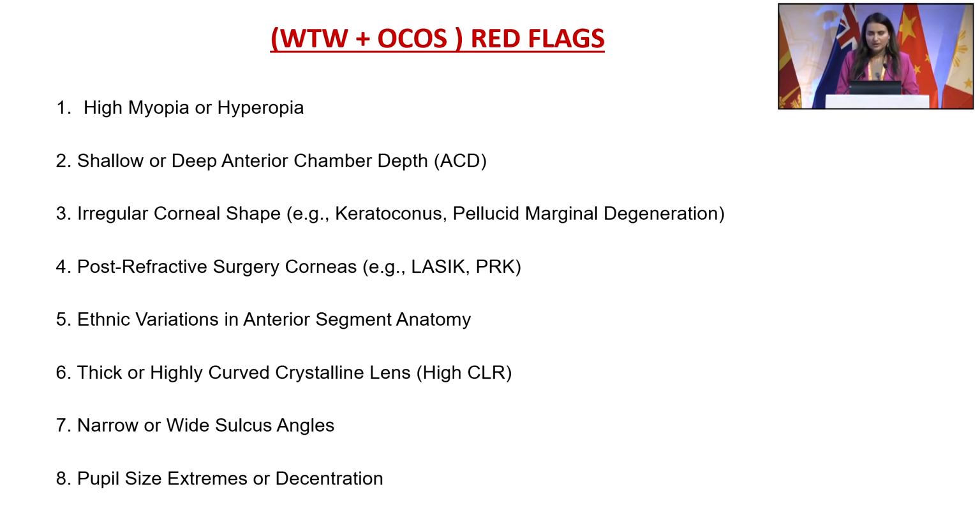Extremes of the chamber depth, very shallow and very deep chamber depths, irregular corneal shapes, post-refractive surgery eyes, post-LASIK, post-PRK, ethnic variations, thick or highly curved crystalline lens, which is the high crystalline lens rise or the CLR, very narrow or wide sulcus angles also, as well as pupil size extremes or decentration.